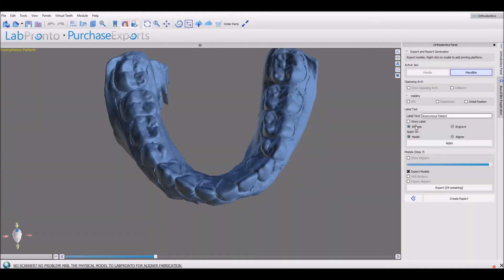We have improved the emboss and engrave functionality for the model and for aligners. When buttons are placed onto models, the last model is automatically exported twice, once with buttons and once without buttons.